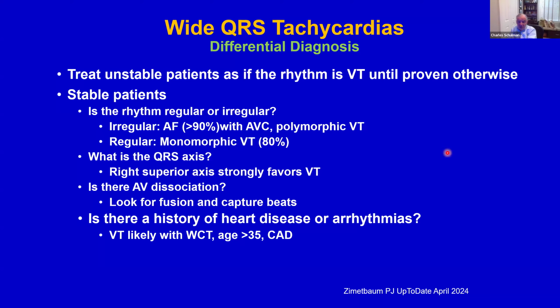Okay, now considering wide complex tachycardias, the differential diagnosis is very important. Dr. Peter Zimetbaum, who is the Assistant Chief of Cardiology at Beth Israel Deaconess Medical Center in Boston, where I practiced, gives this way of approaching the problem, as printed in UpToDate.